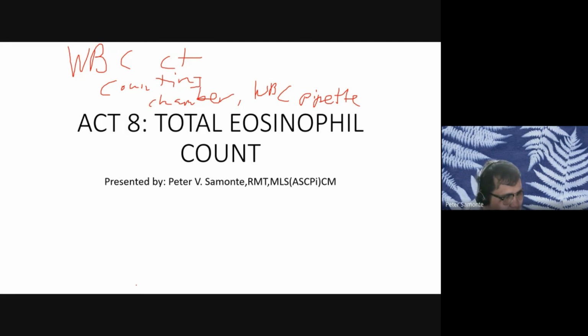What is the main component of your WBC diluent? Okay, you have your glacial acetic acid.